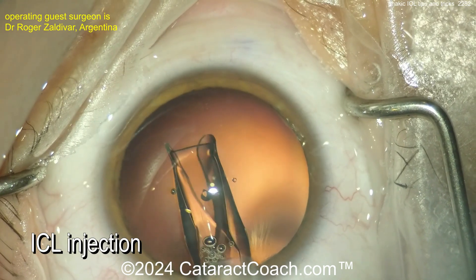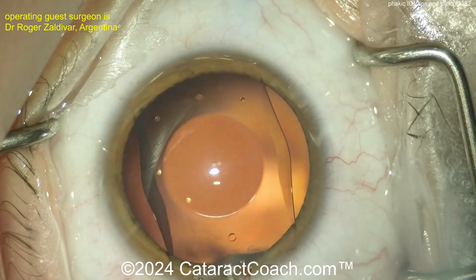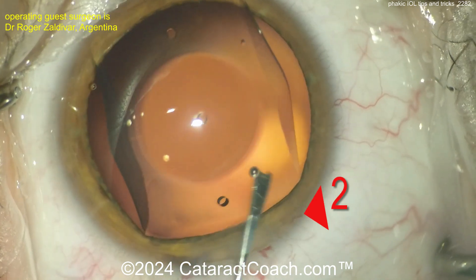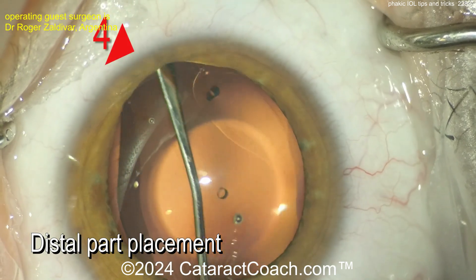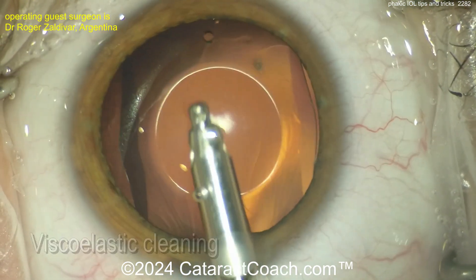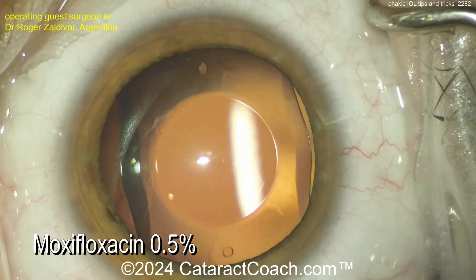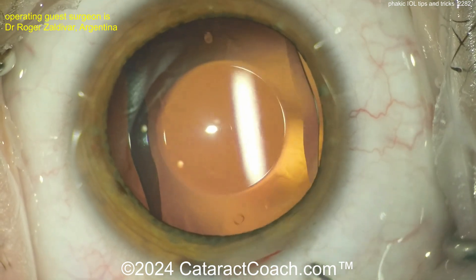The idea is to put this in the ciliary sulcus under the iris with those tabs. Here it is in the anterior chamber and now a little more viscoelastic — that's the HPMC. And now tucking all four corners: there's one, here's two, and then coming across the eye, there's three and four. Now all four corners are tucked — pretty easy. Removing viscoelastic now from the eye. It looks like that was just done through the main incision. Hydration of the incision, little antibiotic going in. Looks pretty darn good. That's a routine kind of case.